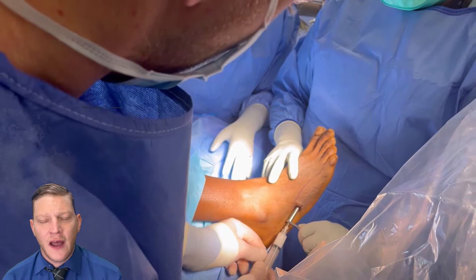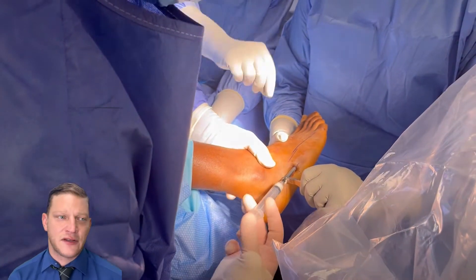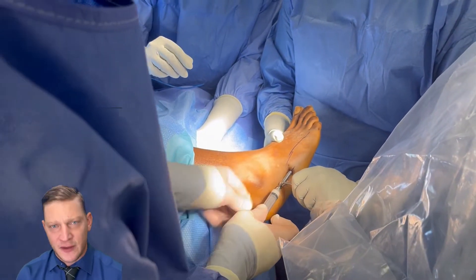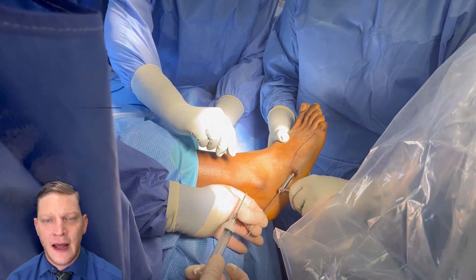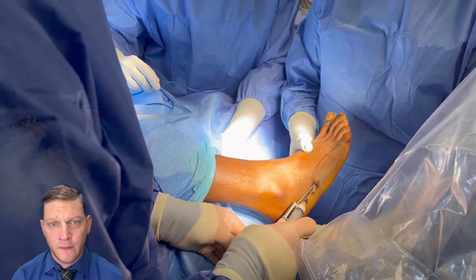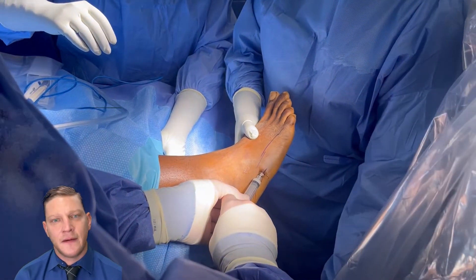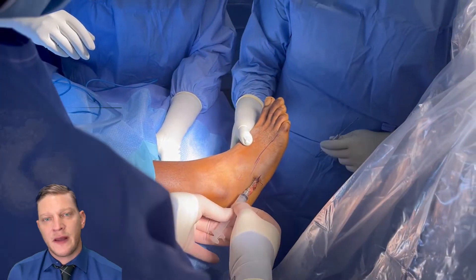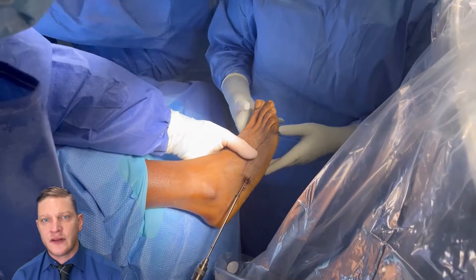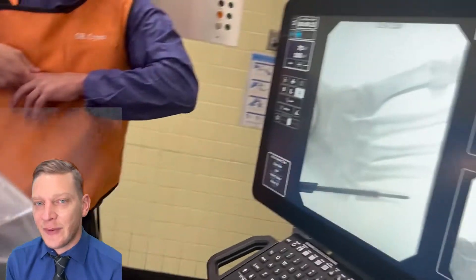You can see a little bit of diastasis of the fracture zone as I'm tapping. I think it reveals there might be an extra fracture fragment. If I had noticed that fragment prior, I might have used a hook plate, but it worked out — this patient is healing very well, weight-bearing as anticipated with no pain. I would make the same decision again knowing what the outcome is today.